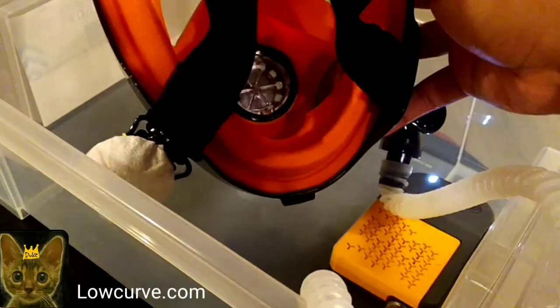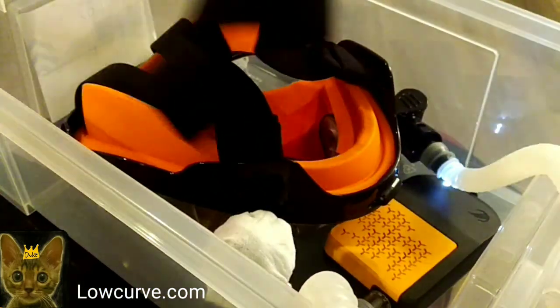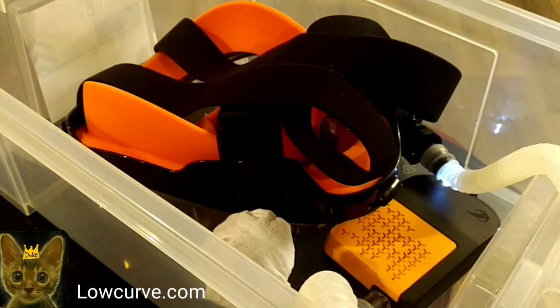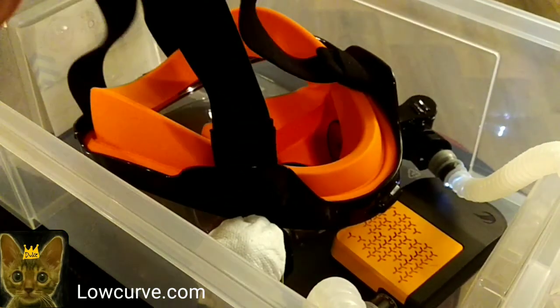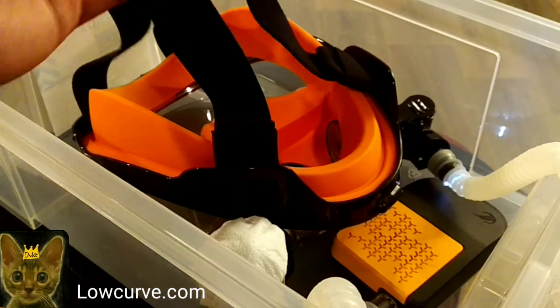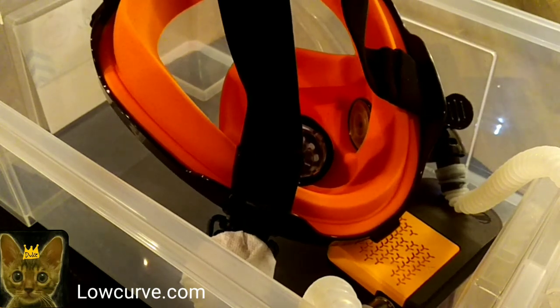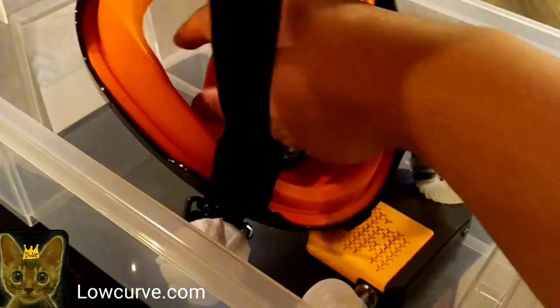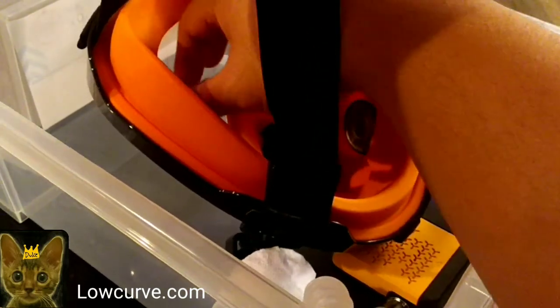So now the air is going in through here, filtering, getting pushed through this tube, in through here, and into the mask. This fan right here is actually kind of weak, and for the price you pay for the unit, it's really kind of lackluster, which is why I decided to come up with the Infinite N95 version 4. It'll still serve its purpose, but I figured I could do it better and cheaper in a way, so I came up with that. It still results in a really good breathing experience, as well as a reduced chance of fogging. So you still get a nice little breeze on your hand here.